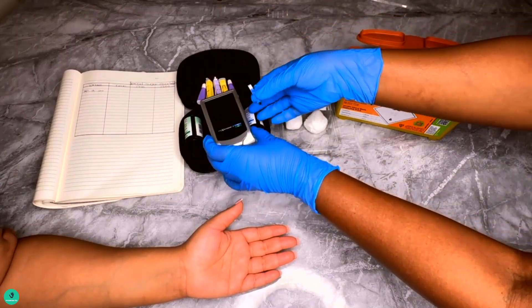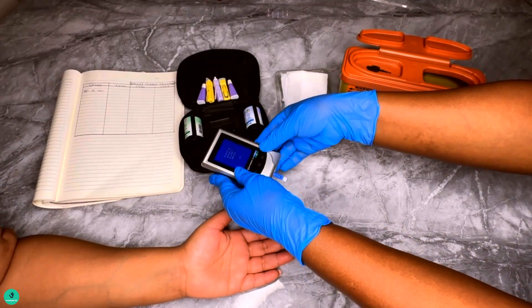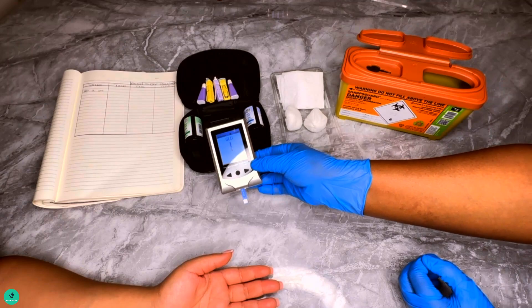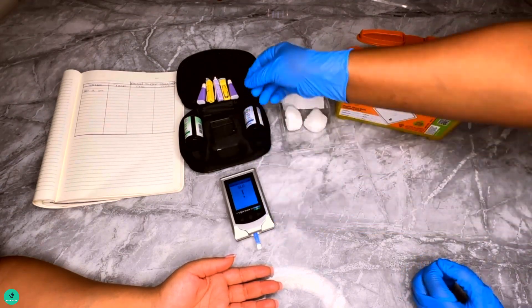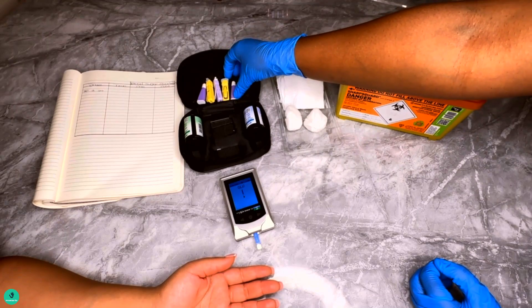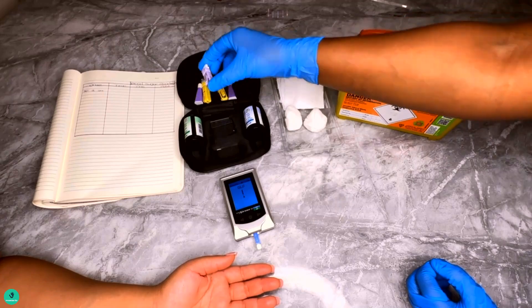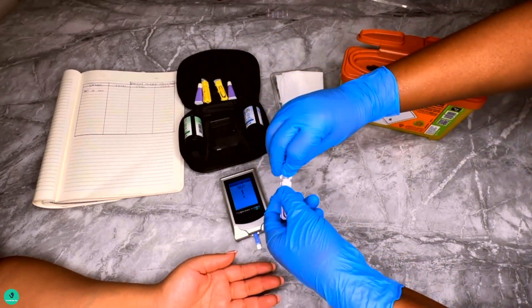Number five: prick your finger with the lancing device at the sides of the finger, as there are less nerve endings here than at the tips. The World Health Organization recommends the middle or the ring fingers — that's the second and the third fingers — to be used for blood glucose tests.